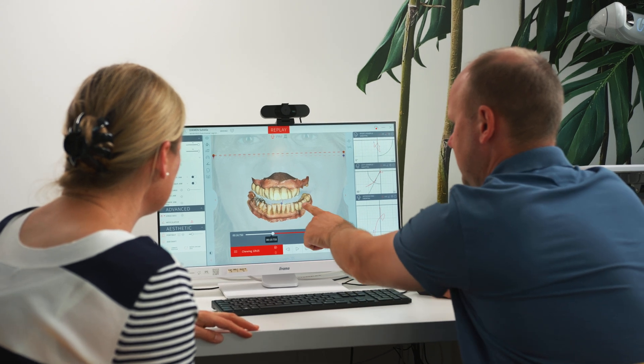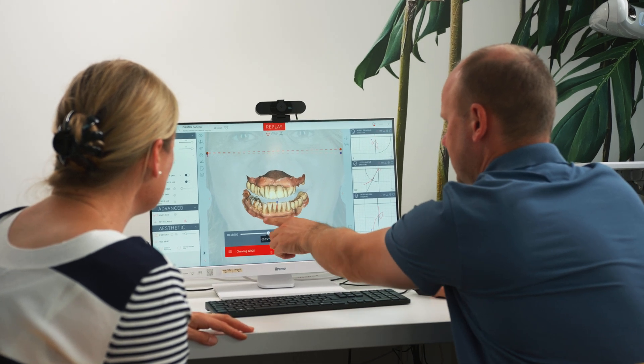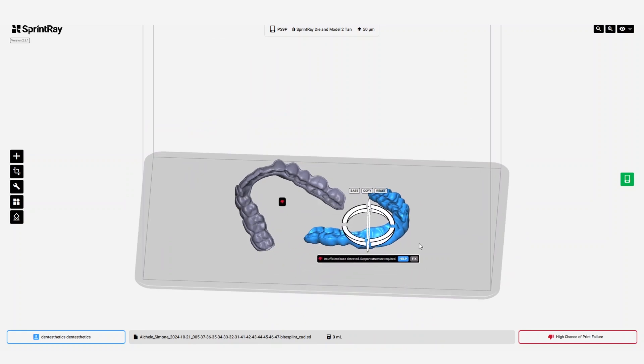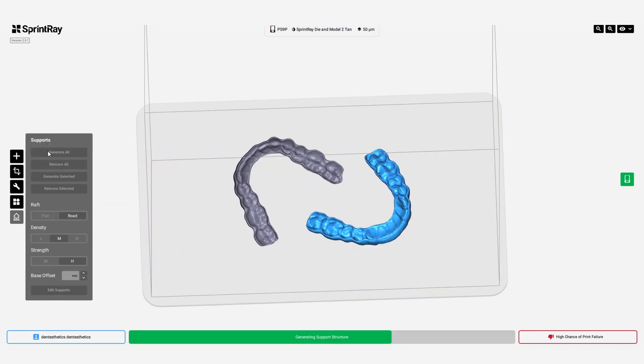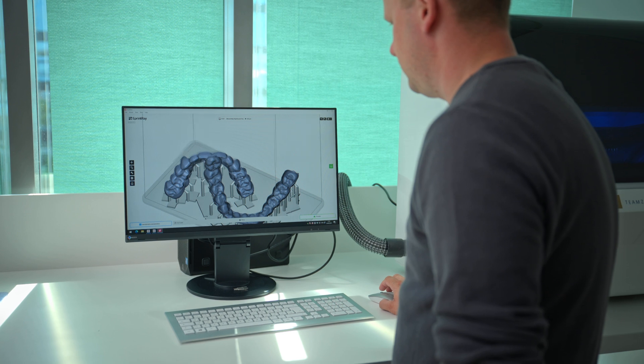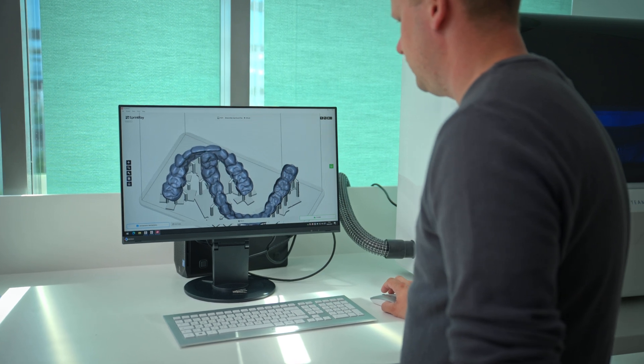I recommend sending a PLY file to the lab. The technician can then decide whether to use the color information. With this data, you can create a digital model using lab software like 3Shape or Exocad. Once you're happy with the design, prepare it for 3D printing. This involves exporting the file from the lab to the nesting software, where you can place the model onto the building platform and add support structures if needed.